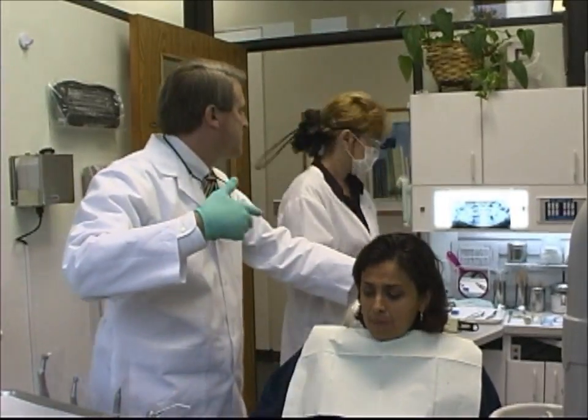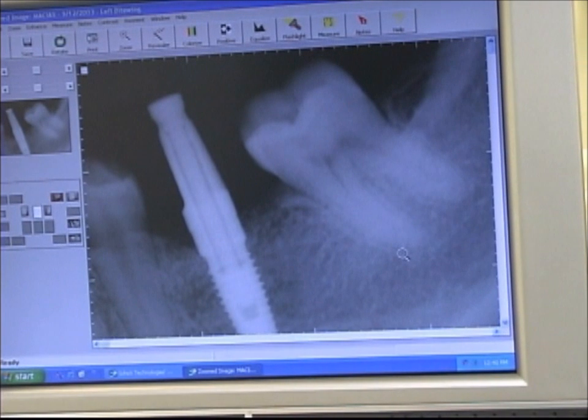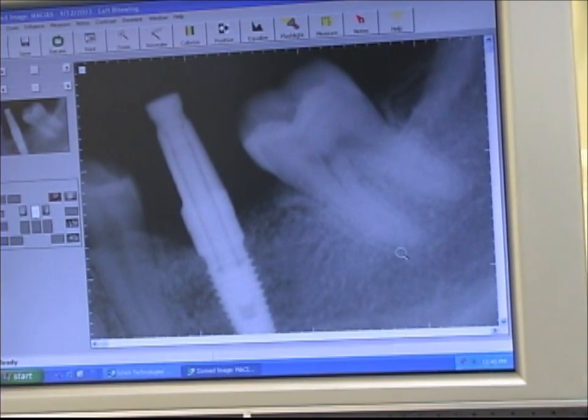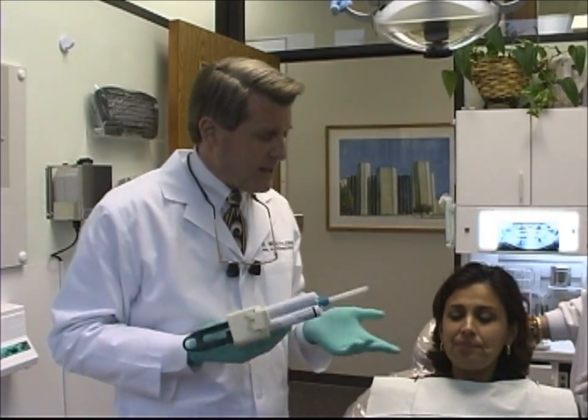Let's go ahead and take a conformational x-ray. We can see that our conformational x-ray indicates that our impression transfer post is completely seated. Whether or not this needs to be done with the internal design is a matter of opinion, but we like to do it, and some laboratories even require it before they would take on a case, especially if we're building from the fixture level. In addition to our upper alginate and lower full arch tray, we need to take a bite. Whether or not the lab decides to articulate the case by hand is a matter of their option.